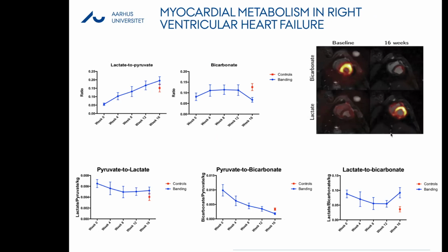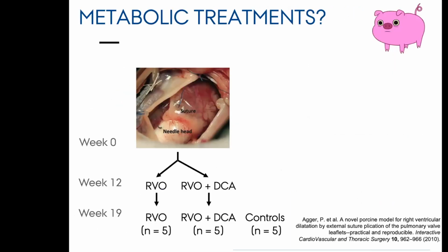So it's sort of a gradual thing, so you don't get chronic heart failure immediately. It's something that evolves over time, and this technology can be used to monitor it and also predict it, and that's also what we showed in the patient data I showed you earlier.